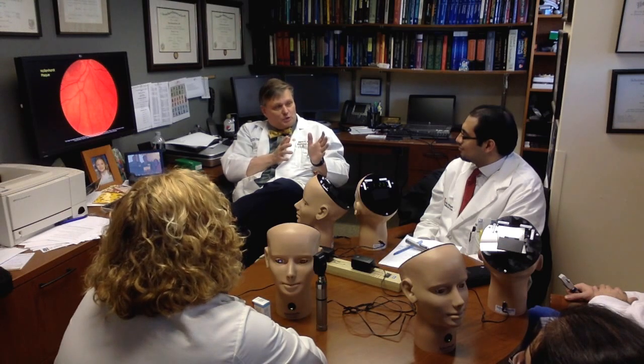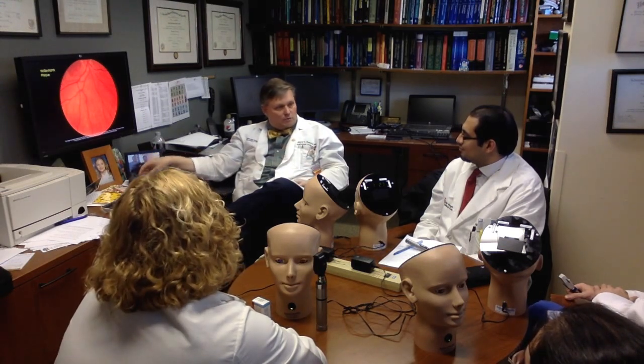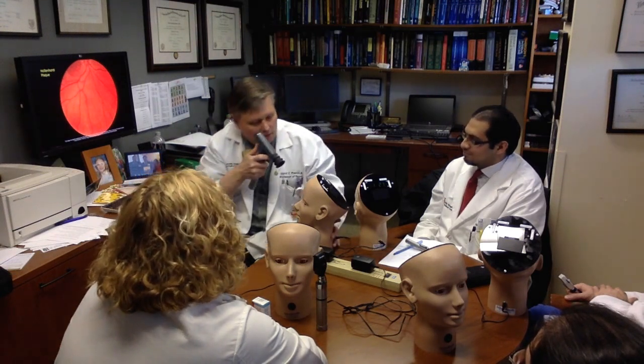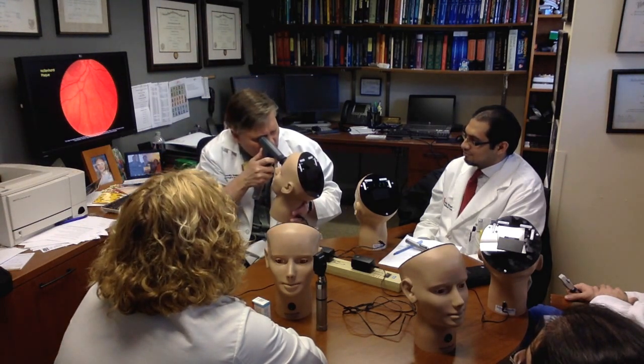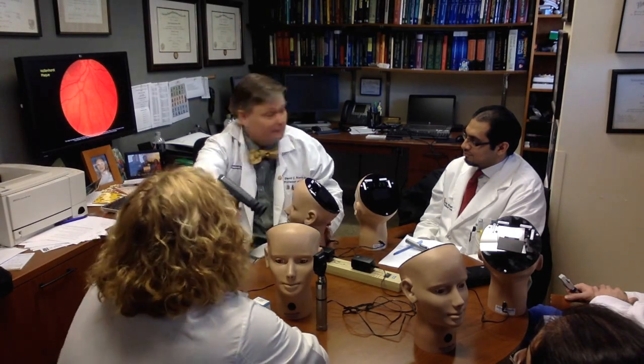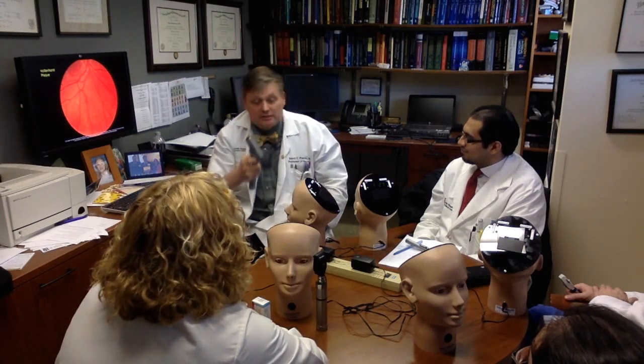Because this is my view, before we did this, this is my view of ophthalmological training in the United States, okay? The attending would look in and say, yeah, I think the nasal margin's a little bit blurred. Yeah, it's definitely a little bit blurred. Here, take a look, okay? And the resident would take a look and say, do you see it?